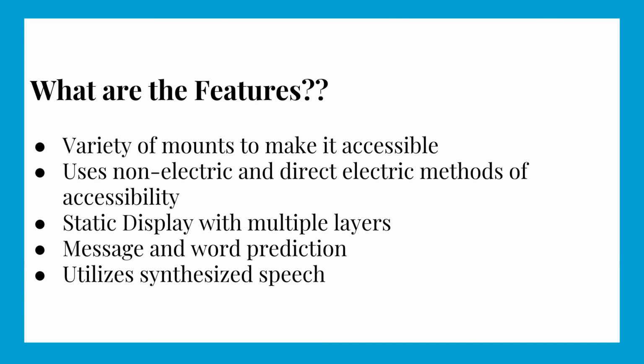And lastly, I'd like to utilize synthesized speech. Now, I really like the idea of digitized speech. But because this app is so big and because there's such a wide variety of words, I feel like it would be really hard to go in and get all the phrases and words that we would need to actually make it accessible.